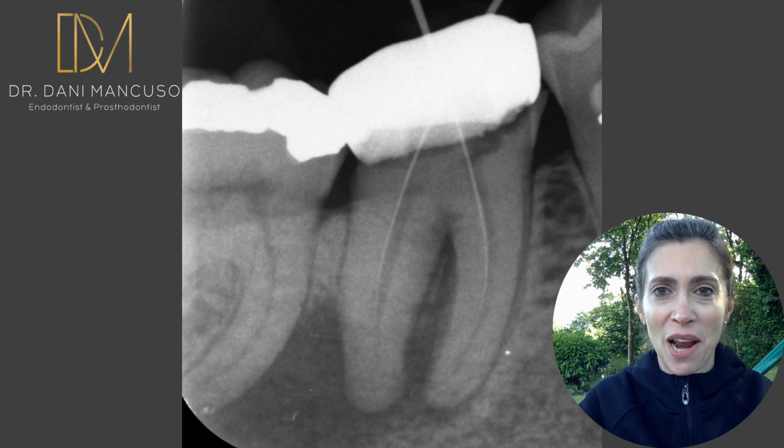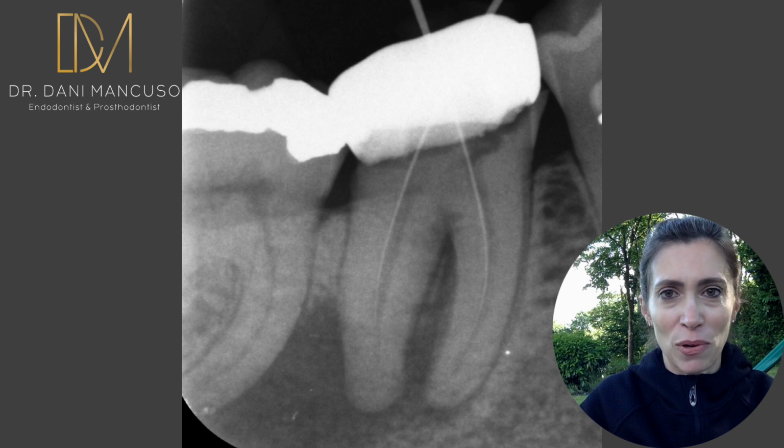Got that doubt regarding how many lateral canals are in a tooth? Well, I'm Dani Mancuso, specialist endodontist and prosthodontist, and I'm here on the 26th episode of the Diary of an Endodontist, and I'm going to show to you. Well, if you are trying to find how many canals using a conventional x-ray, that is impossible, unless that lateral canal is really large for you to be able to see it.